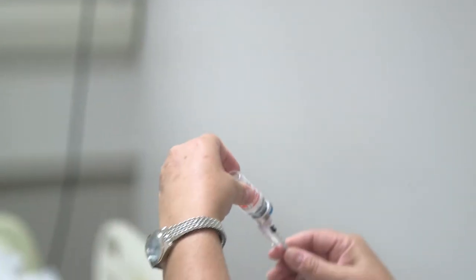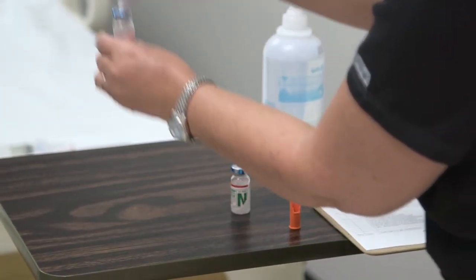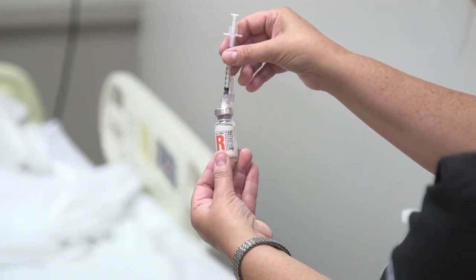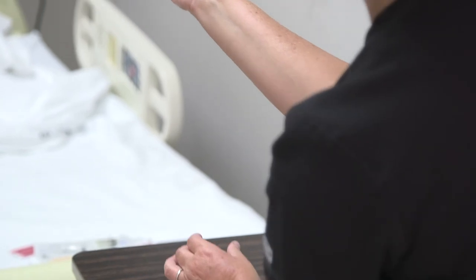I'm going to bring my assistant RN in to double-check that I have five units of regular. I have regular insulin here for Sylvia Vasquez — she's getting five units. Here are my five units, as you can see.